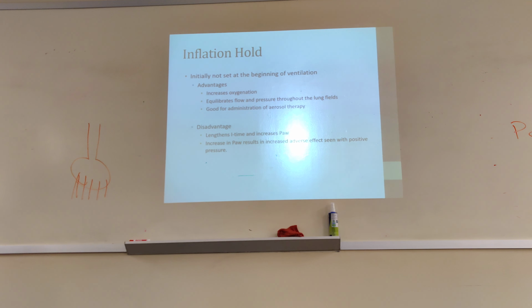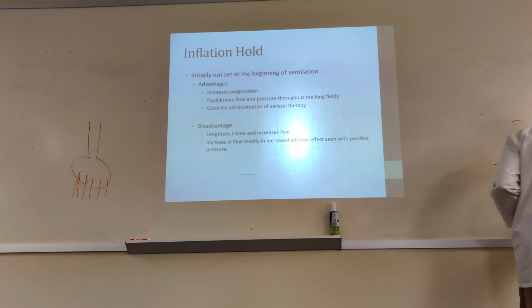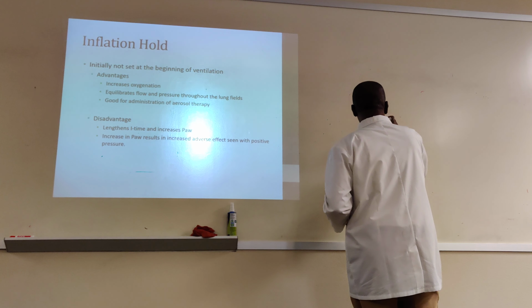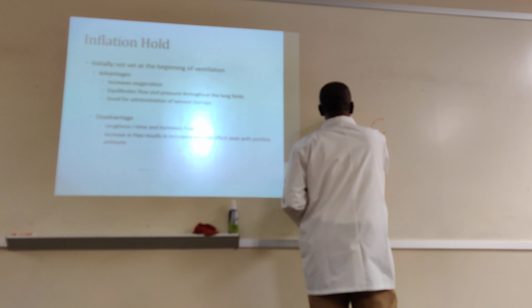Now, there is something called time constant. Mrs. Cathy Brewer went over it in the previous ventilation plans. Time constant.